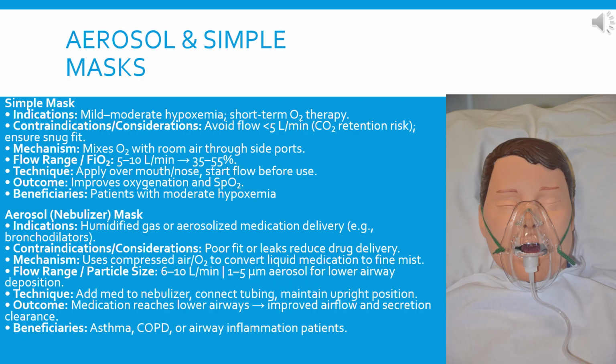Technique, apply over mouth and nose, start flow before use. Outcome, improve oxygenation and SpO2. Beneficiaries, patients with moderate hypoxemia. Then an aerosolized nebulizer mask.